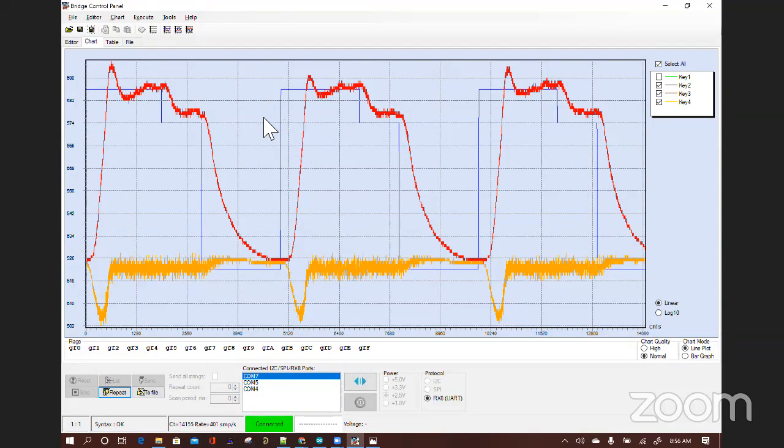The final design will have an interface computer, which will host a touchscreen. This is the simplest and cheapest way to provide controls. And that is separate from the real-time controller for reliability and safety purposes. The real-time controller at this time is an Arduino Nano.